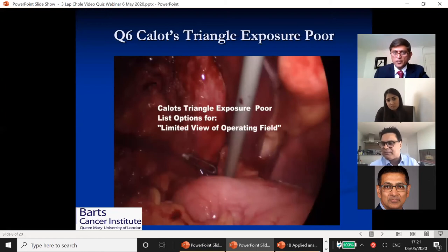Yeah, you might think about converting, you might think about draining if you have perforated already, but here you've really opened it, it's still not late. Stones everywhere, therefore the conversion might be a possibility here. It's much more a possibility than it was a while ago. But those things are on your mind as you proceed.